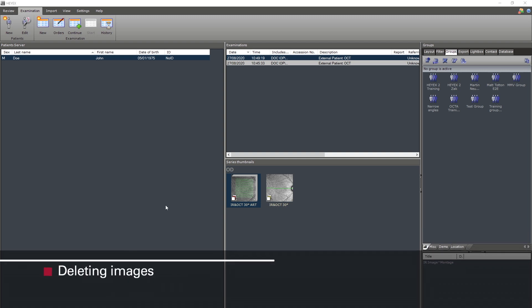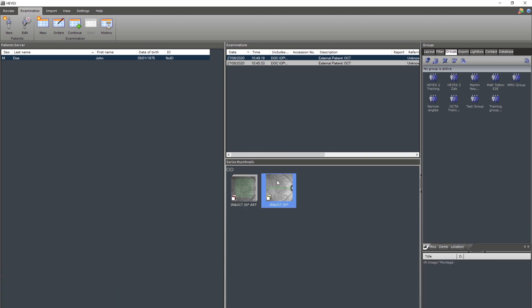To delete any unwanted scans, select the scan you wish to delete and press delete on the keyboard.